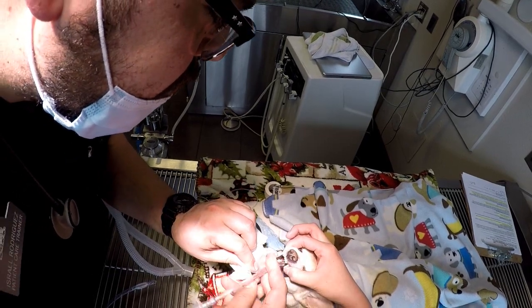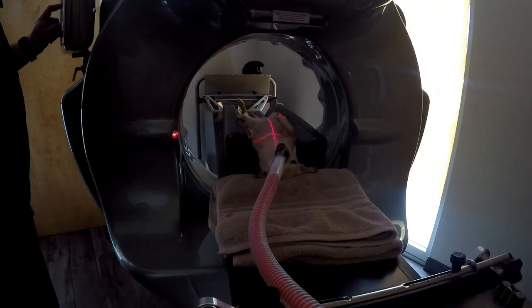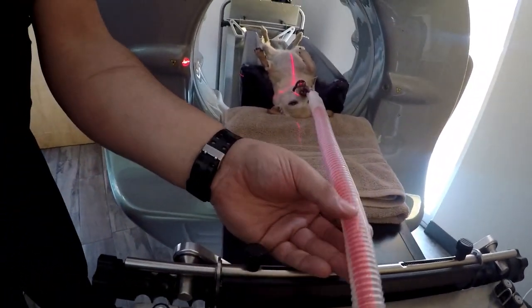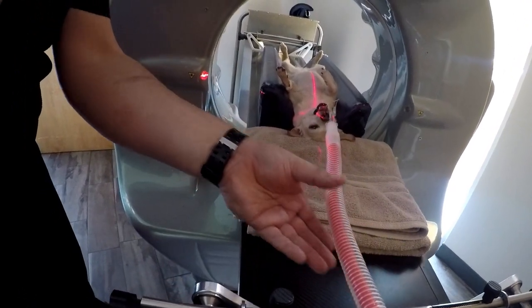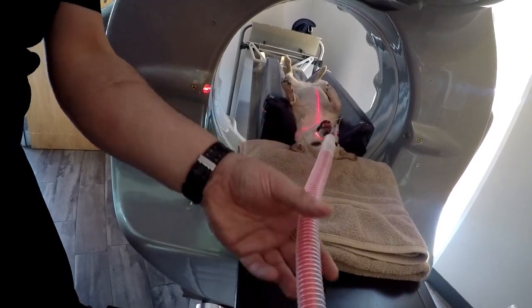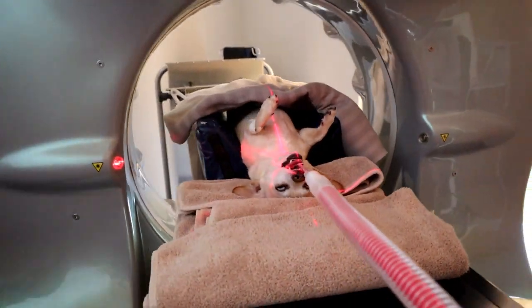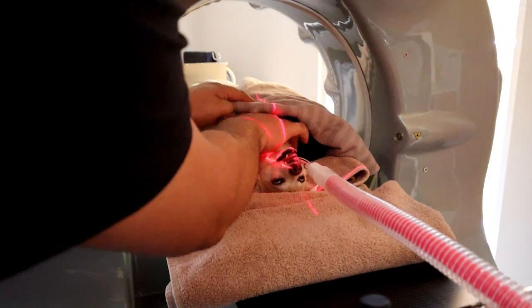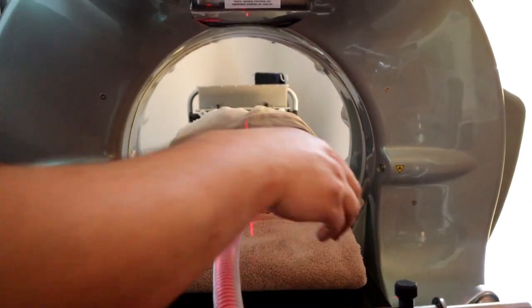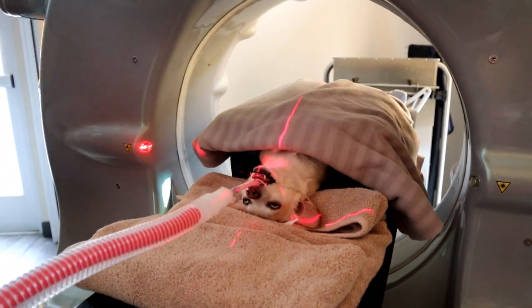Once she was anesthetized, my co-worker Izzy intubated her and then we were ready to move her over to our CT machine. Here we are now trying to get her nice and lined up and trying to get those lasers right in the middle of her mouth. We also tucked her in with a blanket just to help her maintain her body heat a little bit better. She's trying to look nice and symmetrical.